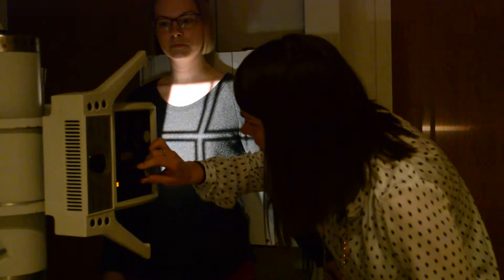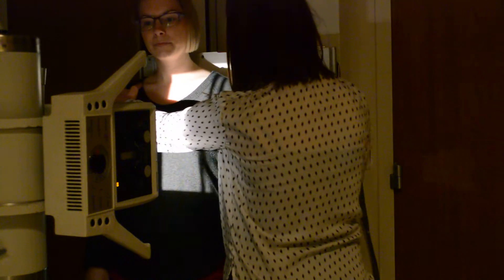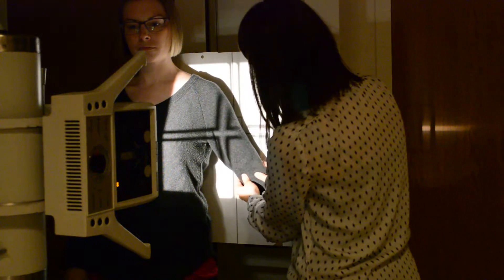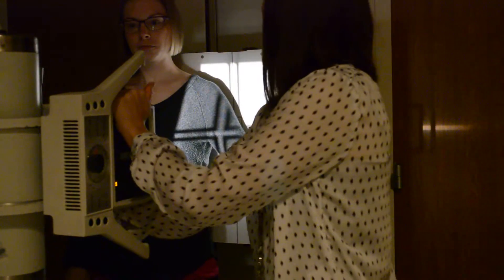You're at 40 SID, so my cassette size is 14 by 17. I'm going to have Libby take a little step to the right and just get your crosshairs right in the center. Make sure you're getting the epicondyles. You should have light above the top of the shoulder. You can collimate side to side for this. You can also turn your tube head for this.